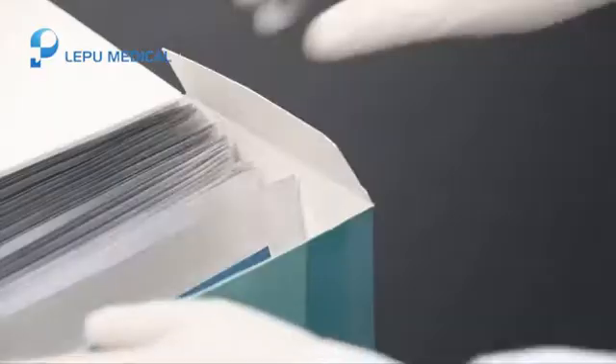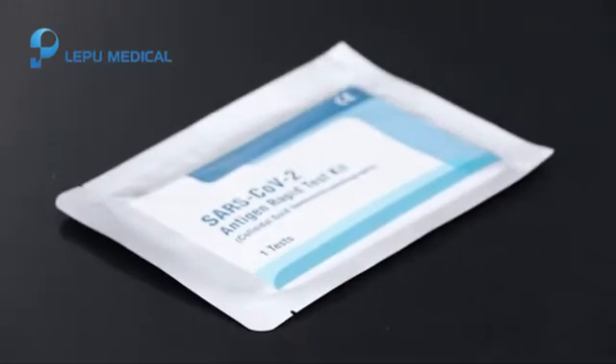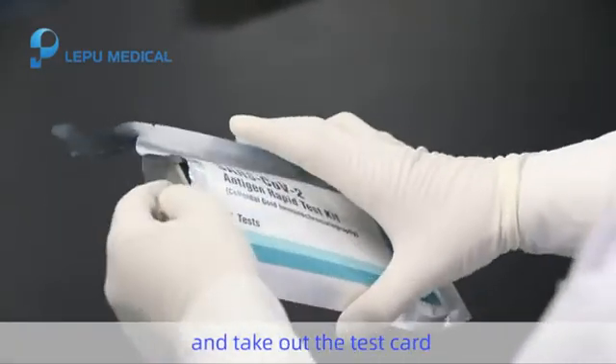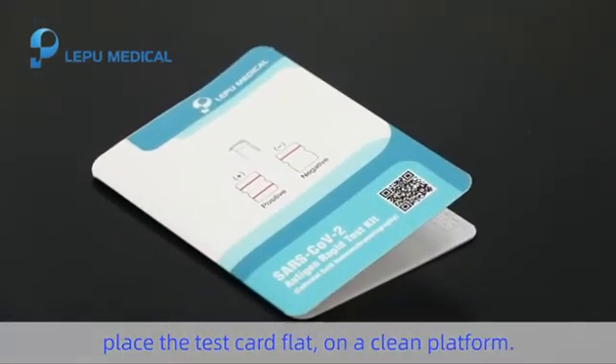Step 1. Tear off the seal of the inner package and take out the test card. Place the test card flat on a clean platform.